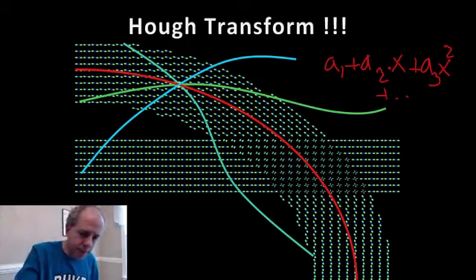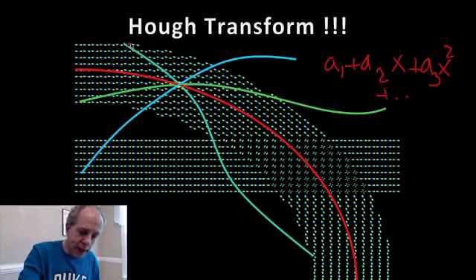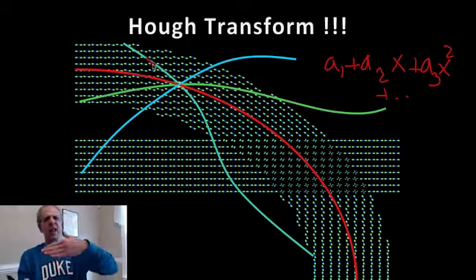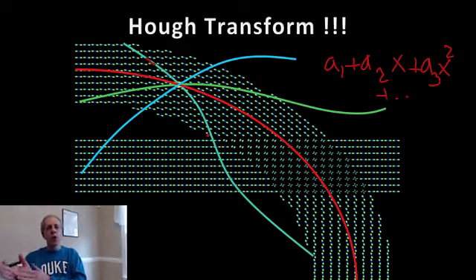Very simple. Remember, at every voxel, we have the probability of going in every direction. So I take this curve, and I say, is this a good curve? I go through the voxel, and I say, what's the probability of going at that voxel in this direction? So basically, the tangent to the curve. And then you go to the next voxel, go to the next voxel, and you keep going. So you add the probabilities that you got from the data of the diffusion MRI.